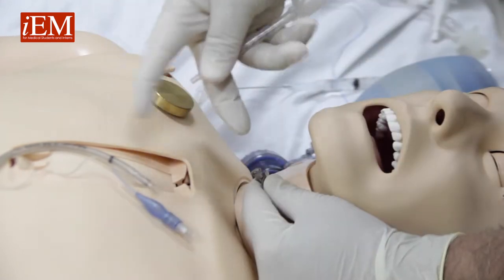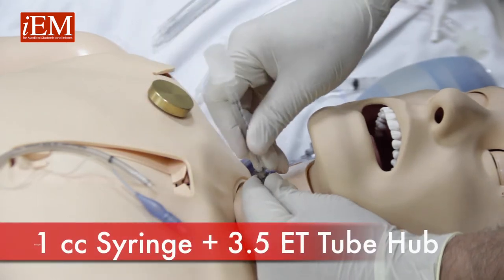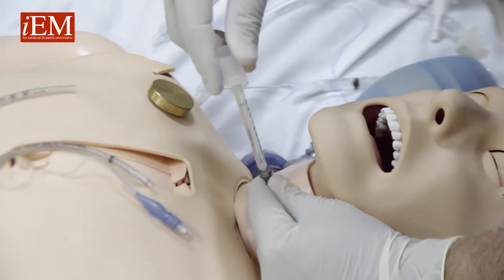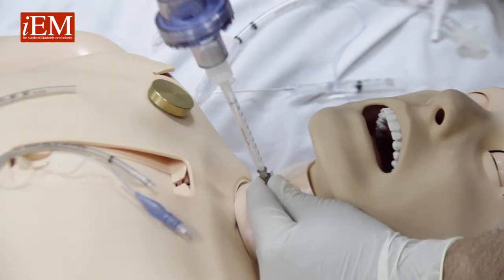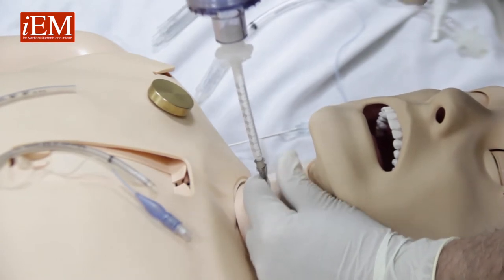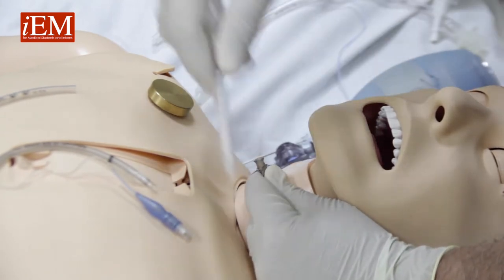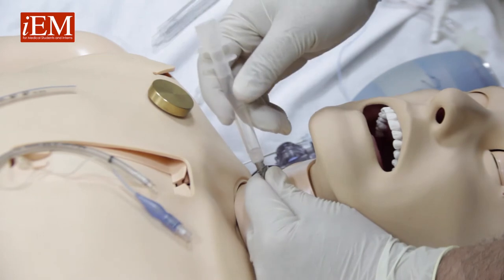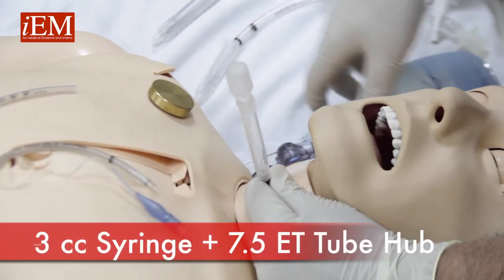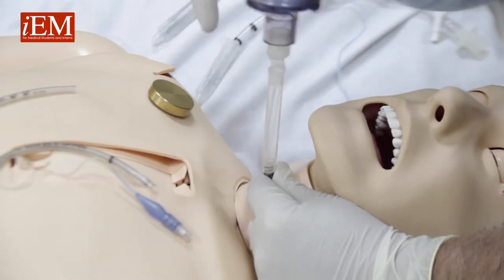Another option: take a 1cc syringe connected to the cap of a 3.5 endotracheal tube, connect it to the endocath, and you can bag. Or take a 3cc syringe connected to the cap of a 7.5 endotracheal tube, and again you can Ambu bag.